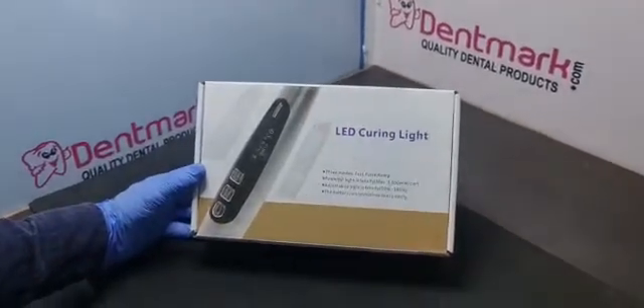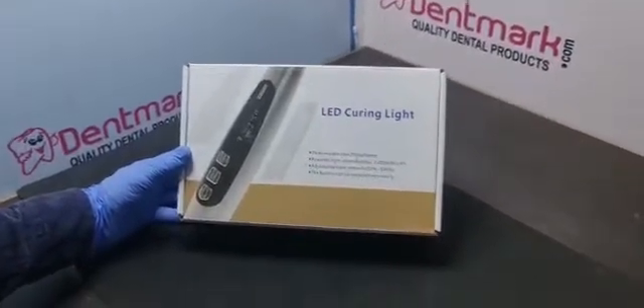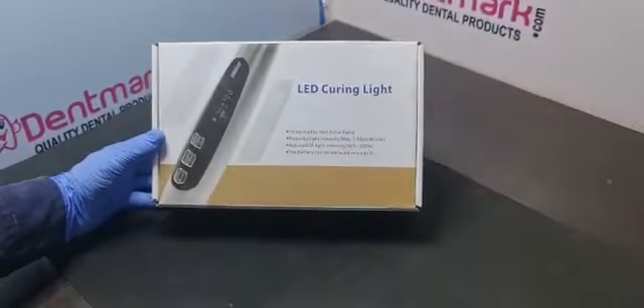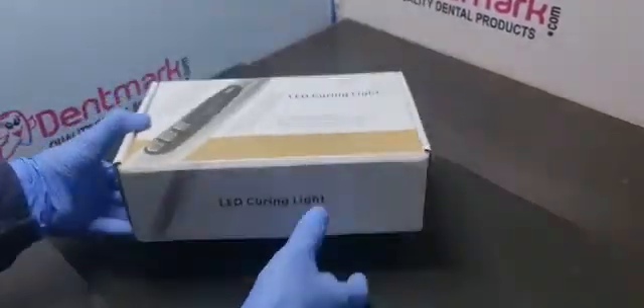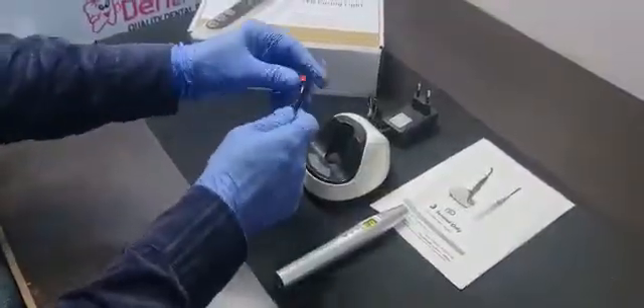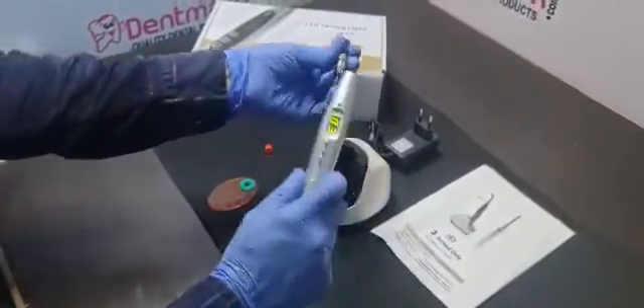Hello friends, this is another model of Denmark light cure LED light cure, the model is LC04. I'll show you how to unpack and use it, and how to fix the parts.